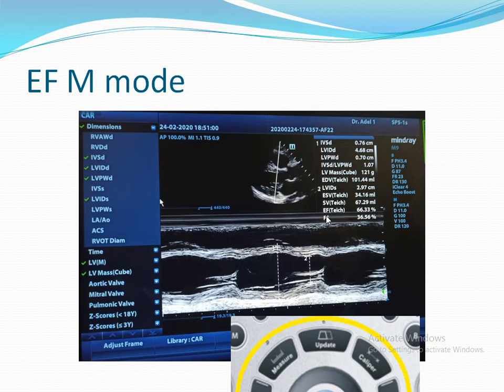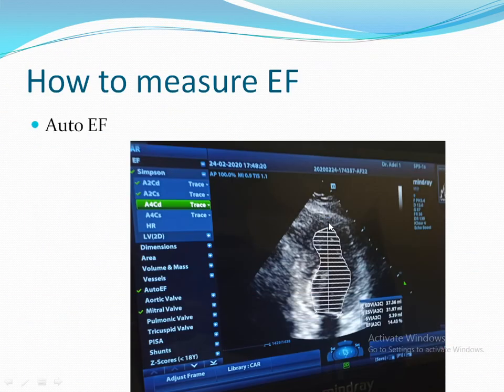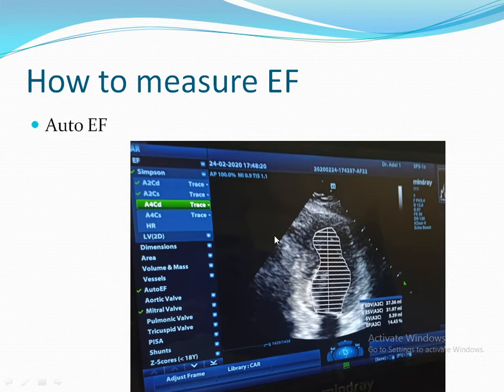To measure Ejection Fraction using auto mode, your ECG cable should be connected and you must have saved a clip while the ECG cable was connected. After that, simply press the Auto Ejection Fraction button and the machine will automatically measure the ejection fraction.